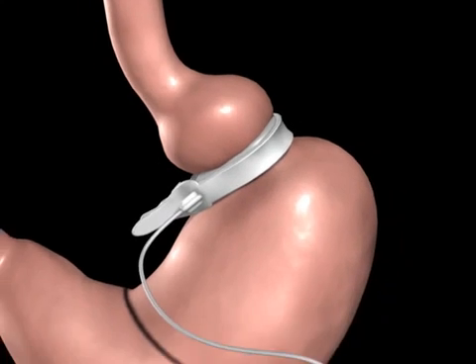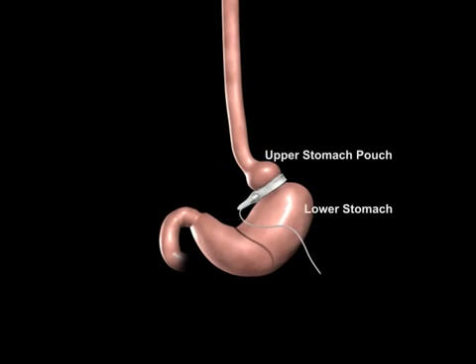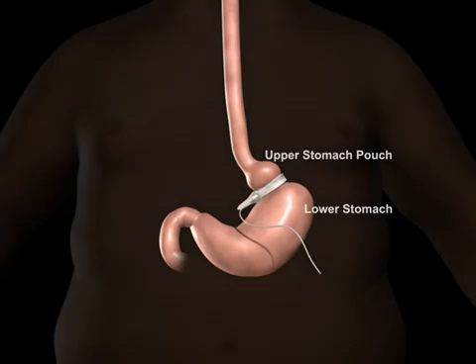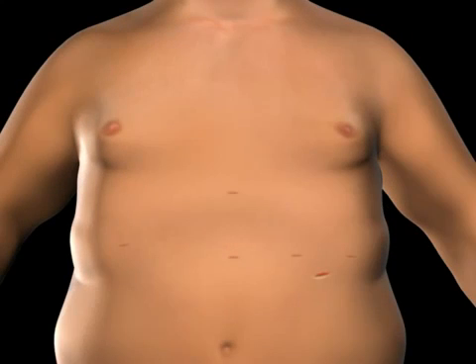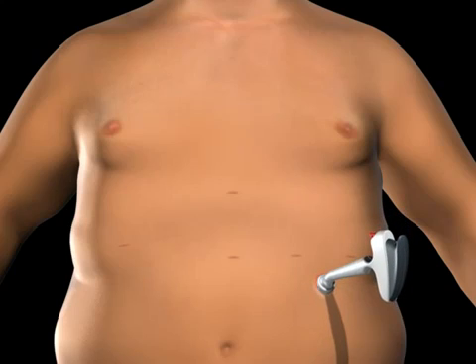A tube attached to the Realize band will be connected to the injection port. The port is used to adjust the band tightness after surgery. An incision is made on the upper abdomen to insert the Realize injection port beneath the skin. The tube is secured using the locking connector on the port, and the injection port and tube are placed beneath the skin.